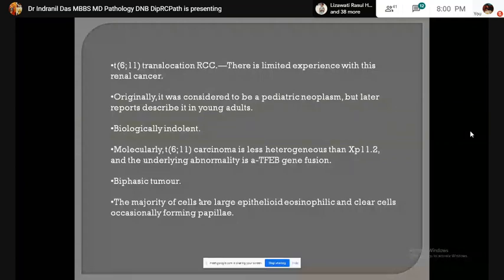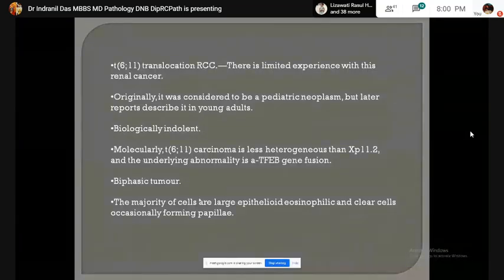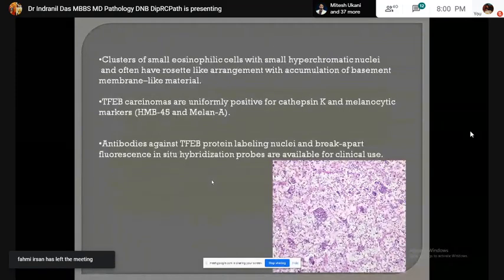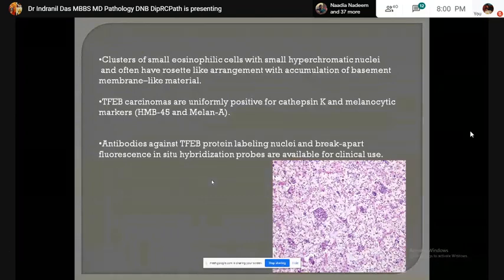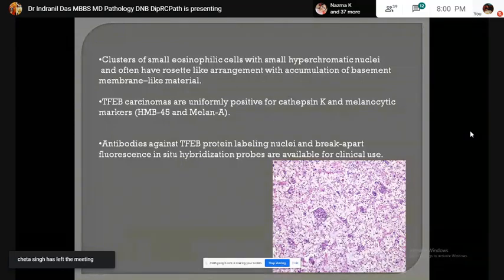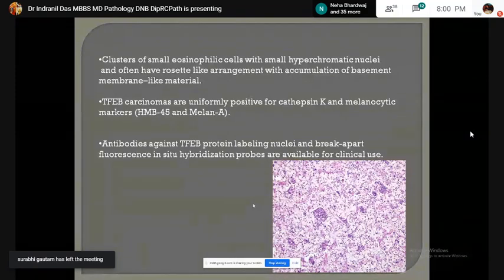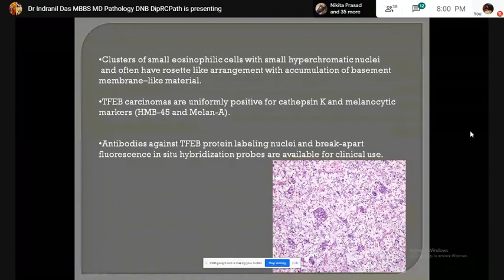Translocation 6;11 carcinoma was initially considered to be a pediatric neoplasm but other cases are also seen. It is a biphasic tumor: papillae formed by large epithelioid cells and clusters of small eosinophilic cells with hyperchromatic nuclei are present. They are positive for cathepsin K, HMB-45, and Melan-A. Antibodies against TFEB are also positive.